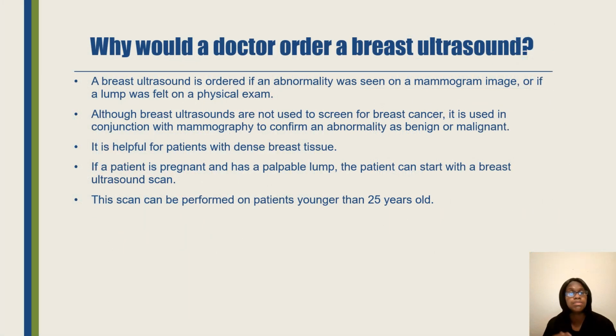If a doctor orders a breast ultrasound, something was seen on the screening mammogram, just a follow up from an abnormal mammogram, dense breast tissue. If a patient comes in with a lump, or if a patient comes in and they're younger than 25 and they can't have a mammogram.